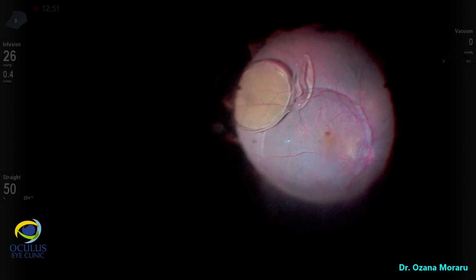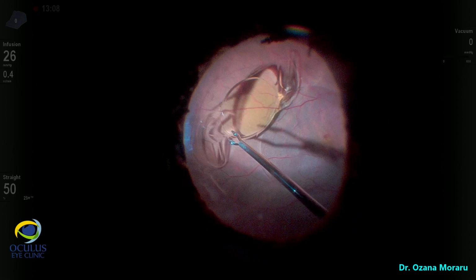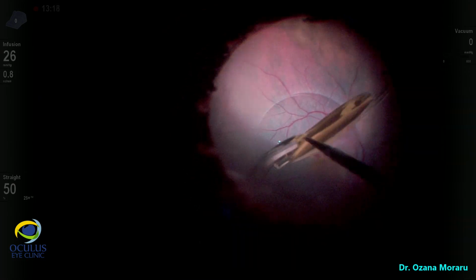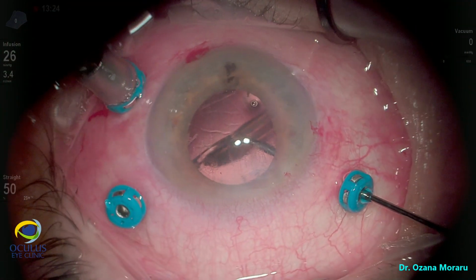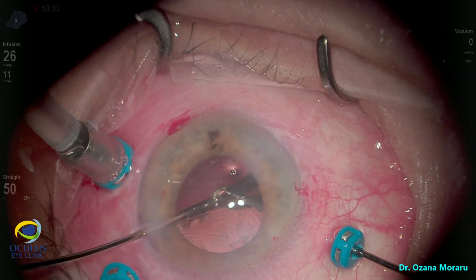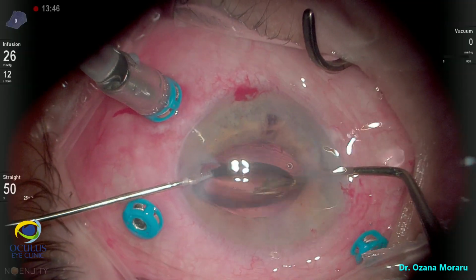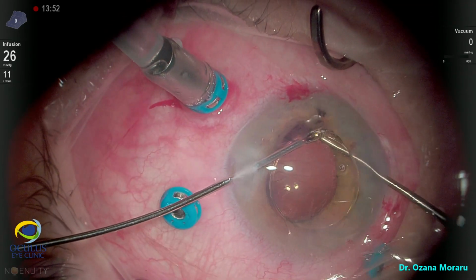So eventually we injected a bit of heavy liquid, perfluorocarbon, in order to protect the macula and to help us in rotating, flipping a bit the IOL, what you see here now, which was very helpful in grasping the IOL further on. We brought it easily to the anterior part of the posterior cavity, and now with a two-hand technique, via the trocars and then via the paracentesis, we bring the IOL in front of the iris, lying in the anterior chamber on the iris.